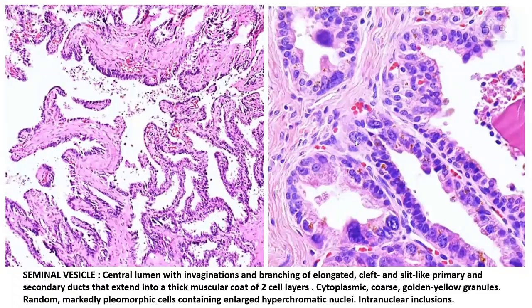Look at the image on the right. It's obvious that there is a significant amount of pleomorphism over here. Some of these cells are pretty large, hyperchromatic looking, and markedly atypical compared to the background cells. This kind of pleomorphism is unusual in a prostatic acinar adenocarcinoma. Remember that prostatic acinar adenocarcinomas are characterized by the monomorphism of the cancer cells, whereas here you have a striking amount of pleomorphism that should set some bells ringing.